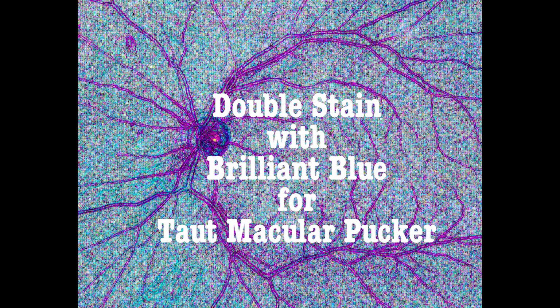We start the vitrectomy. The patient is phakic with a pretty clear lens. Using a wide-angle vitrectomy contact lens, we perform core and peripheral vitrectomy. At this point, we are detaching the hyaloid so as to free up the macula from vitreous adhesions.